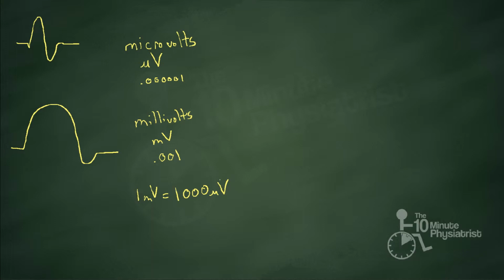I know everyone knows that, but it's sometimes easy to forget, particularly on modern EMG machines that set all the settings automatically. You click on sensory nerve action potential and all the gains are automatically set. Even though those potentials look similar when you record them on a modern EMG machine, remember that underneath it all, they're hugely different, as different as Beethoven and the Empire State Building.